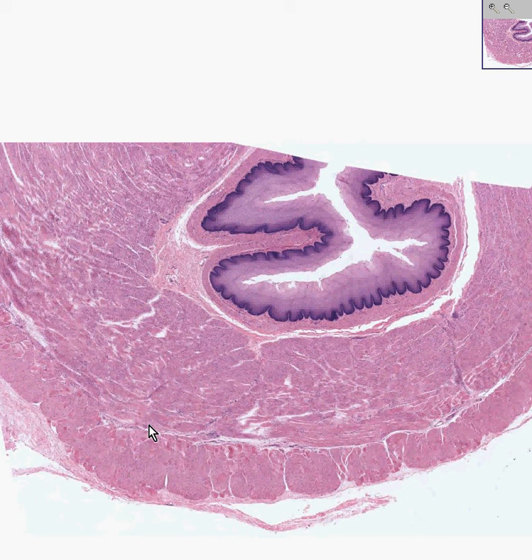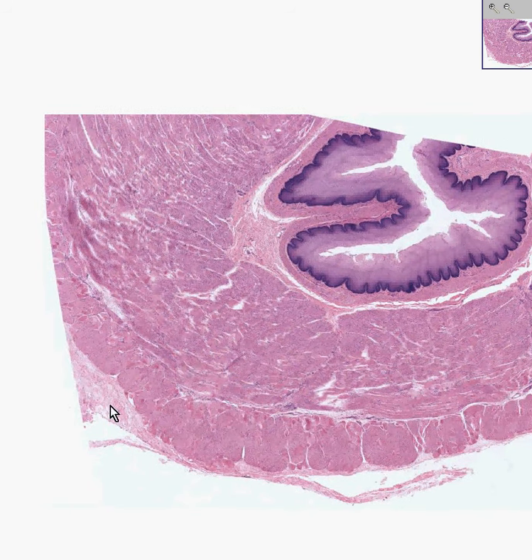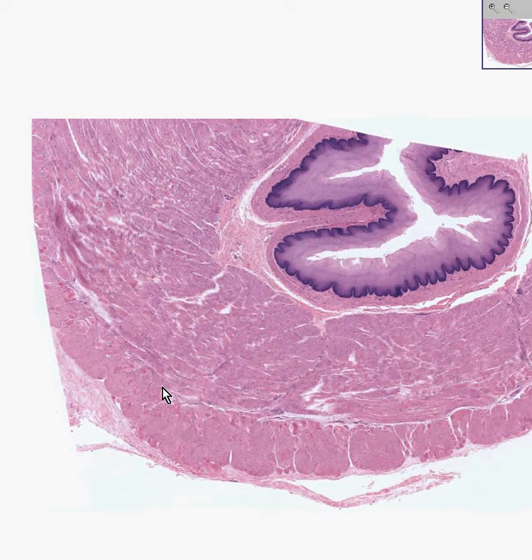Remember that in the upper portion of the esophagus, you may see some remnant skeletal muscle fibers from the inferior pharyngeal constrictor, but throughout most of the mid and distal portions of the esophagus, it's pure smooth muscle. And once again, here is the adventitia. Most of the esophagus is not intraperitoneal, so you could probably call this adventitia.